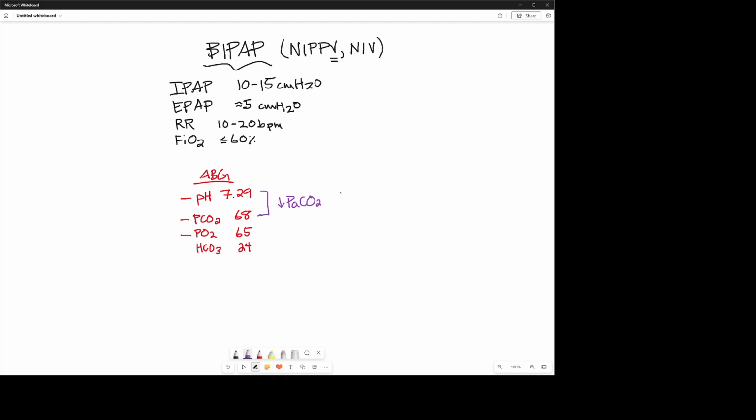And there's another idea or term that they can use to describe this pressure difference. It's not really used here, but we could think of this as pressure support. It's almost the same thing as when you use the ventilator with pressure support. It is the pressure difference between the expiratory and the inspiratory pressures. It's the support, if you will.